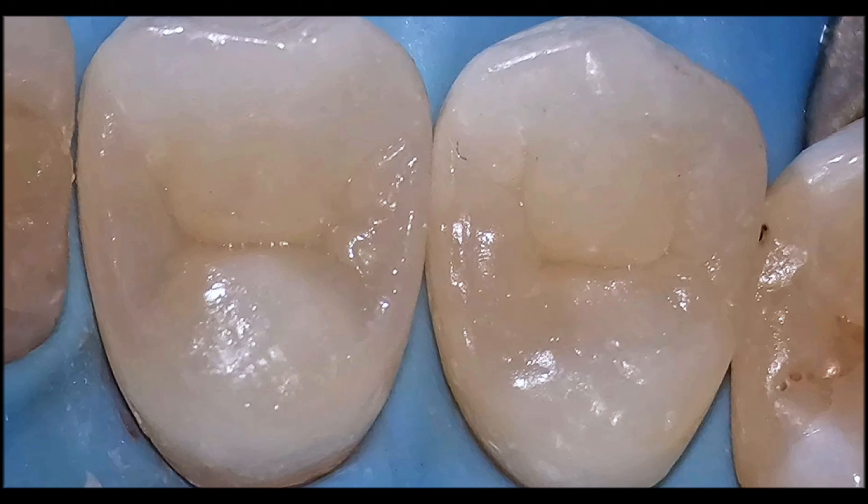This is the result of the direct restorations — we made two direct restorations with nice rounded profiles. The canine and the molar tooth will be restored later on, but this is the case I would like to share with you.